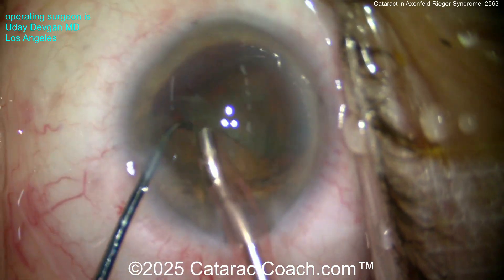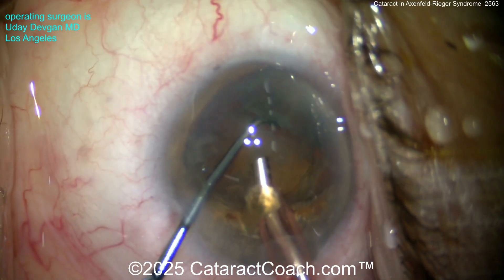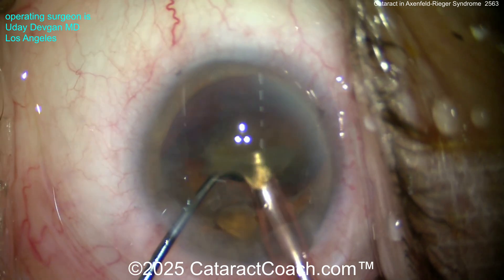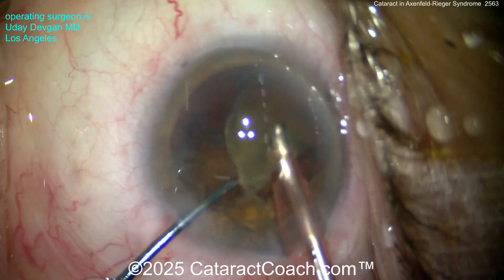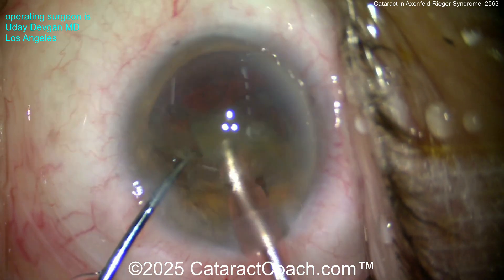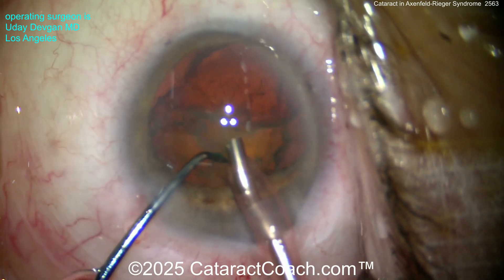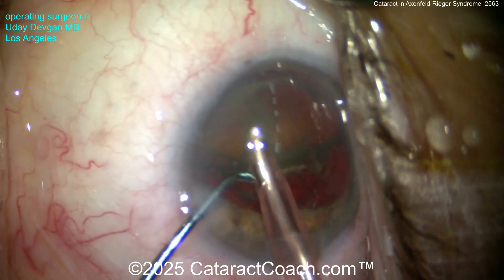Axenfeld-Rieger syndrome was described more than 100 years ago. First, Axenfeld described posterior embryotoxon — anterior displacement of Schwalbe's line, which you can see in some parts here. Then a few years later, Rieger described other findings of anterior segment dysgenesis, such as irregular iris atrophy, corectopia, and different dilation patterns. We can see the cornea here is not perfectly round or oval — it's rhomboid shaped. All these things were associated together and became Axenfeld-Rieger syndrome.